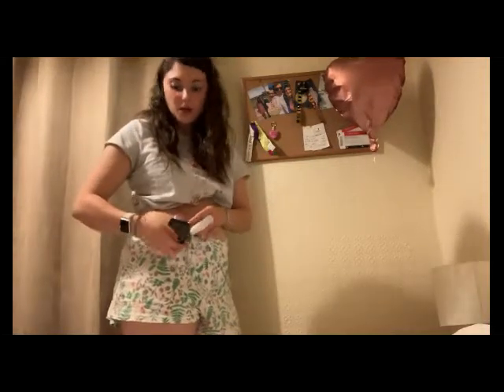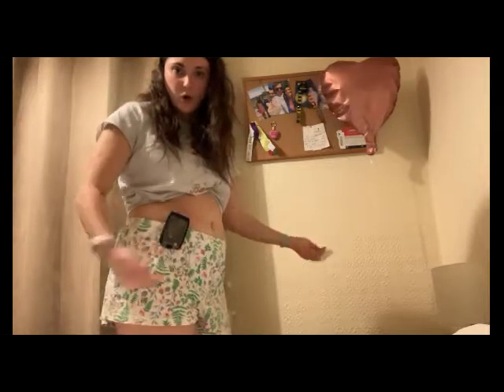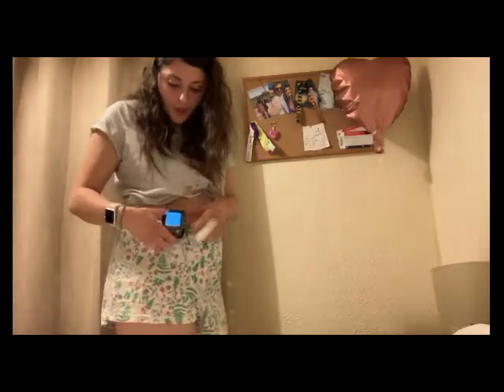So anyway, all I do is when it's on my belt like that, I just press my button and it does normally scan. There we are. Sometimes you have to lift it up a bit and it just scans straight away, and I can feel it vibrate and everything, like I said, and it helps me remember to do that, because I'm very lazy when it comes to checking my blood sugar.